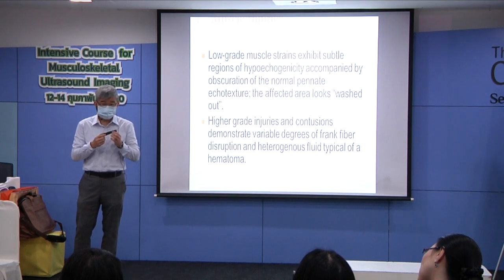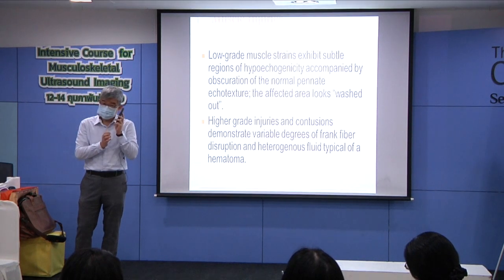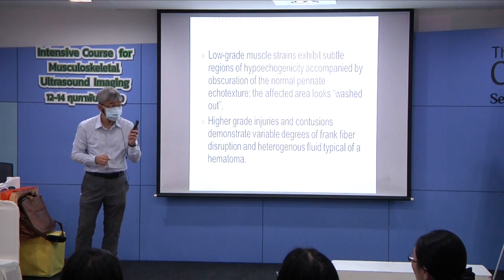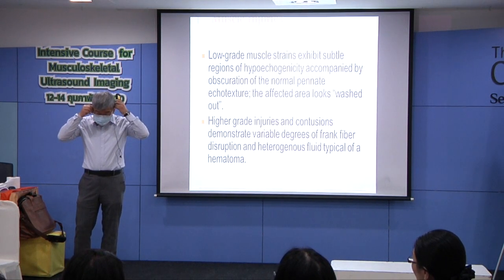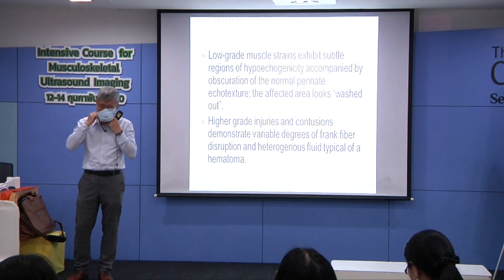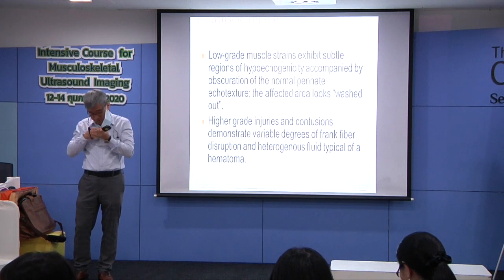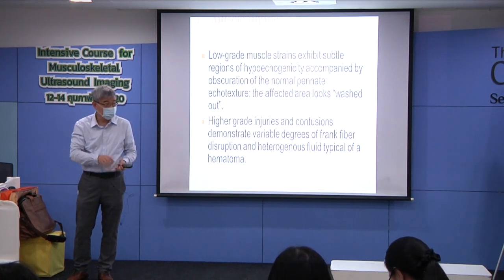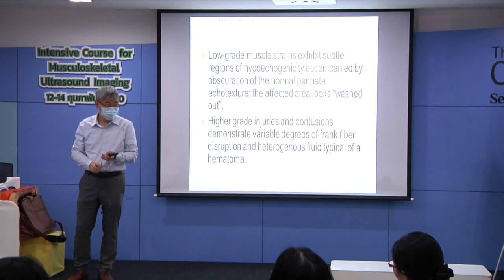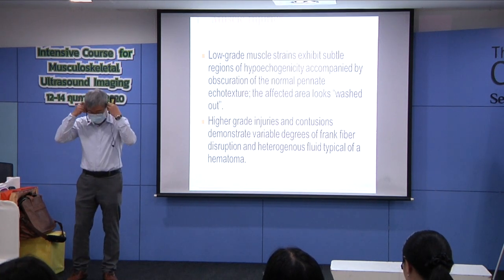So if someone tells you, I got a very good wireless ultrasound, but the price does not come cheap, nonsense. Because you can ask them, is the sound wave provided by crystal or semiconductors? I think most wireless made in China is semiconductor, I believe, because the prices are very low, right? Okay, good.